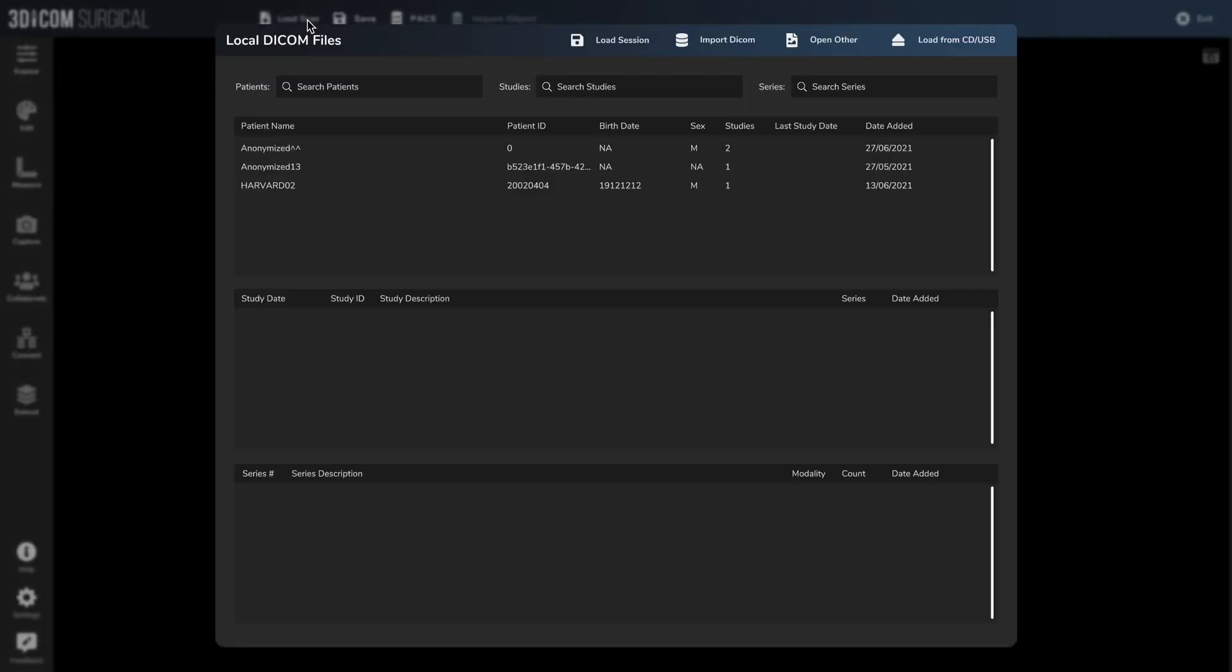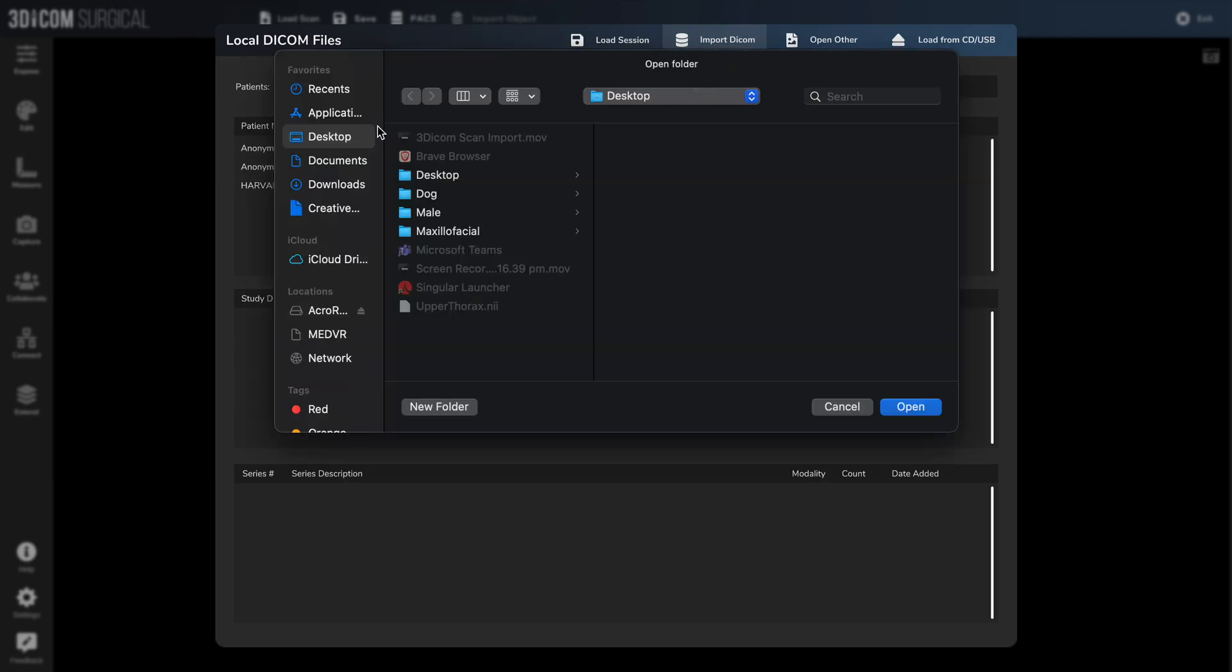So click on load scan in the top left. This is your local DICOM archive where you have patients, studies, and series. To load in a DICOM file, we'll click import DICOM and you can browse through your files like you would normally.